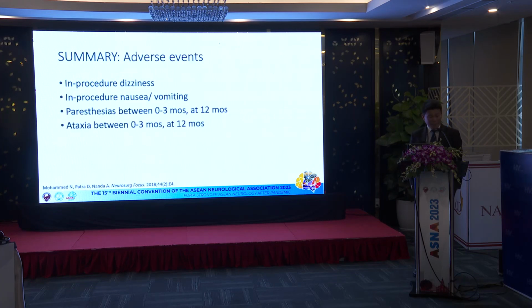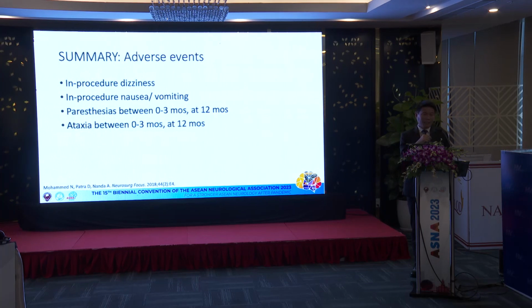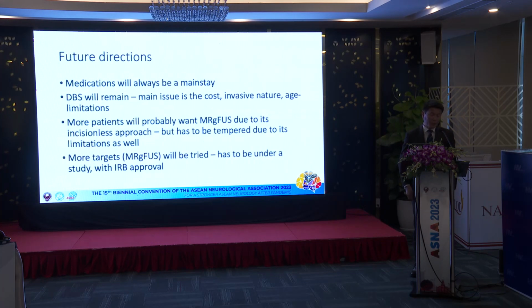In terms of adverse events, there's in-procedure dizziness, nausea, and vomiting, paresthesias between 0 to 3 months and even up to 12 months, ataxia between 0 to 3 months and at 12 months. For our XDP patients, we had 2 patients who complained of central pain, but the target was different. It was the pallidothalamic tract, but there's some pain involved.